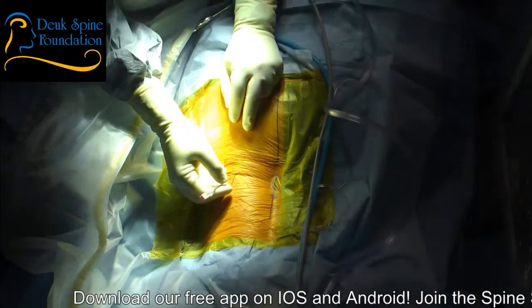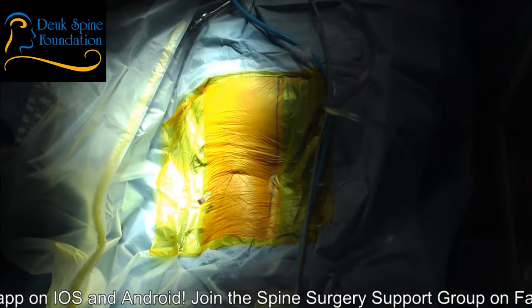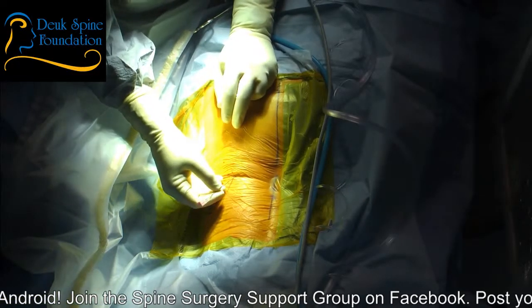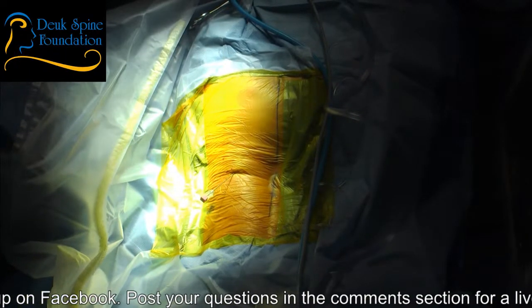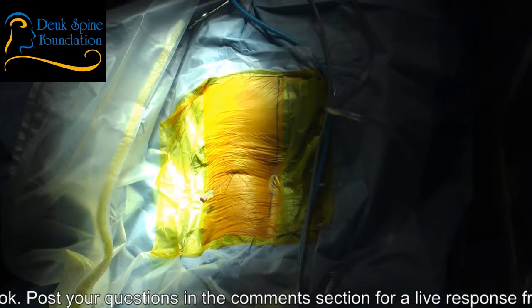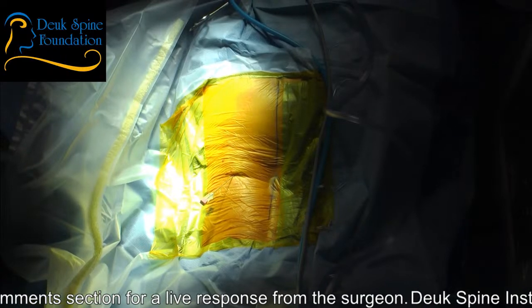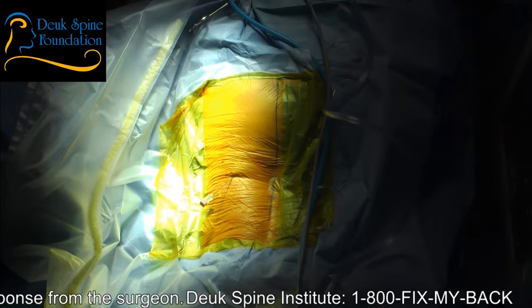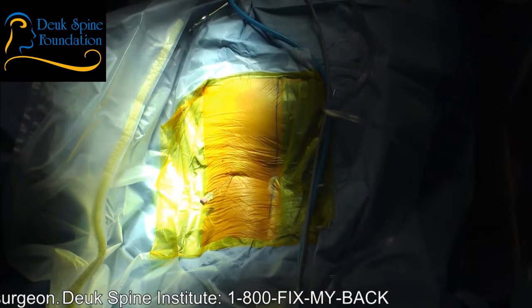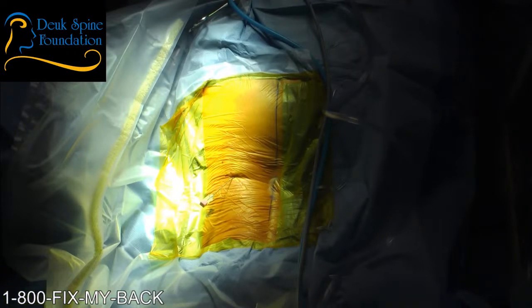Let's see what we can do with the WAG. I think we are a little bit off with the WAG. Let's WAG and see what that does for us. That's worse — let's try it the other way. That's definitely better. Let's try a little bit more and see what happens. I think that's pretty good. I don't think we are going to get better than that.